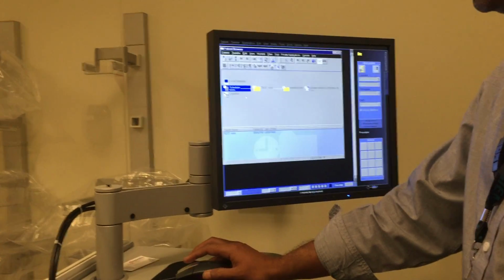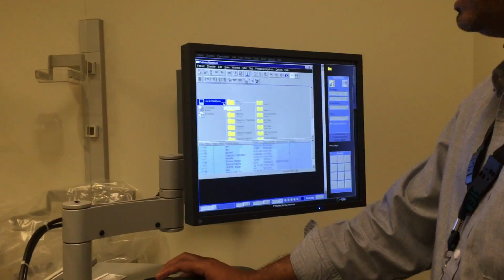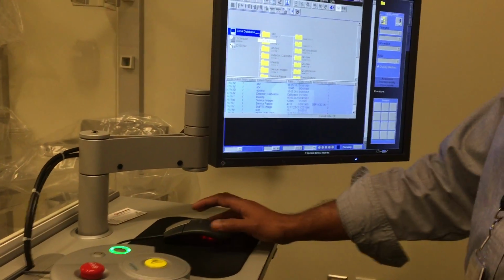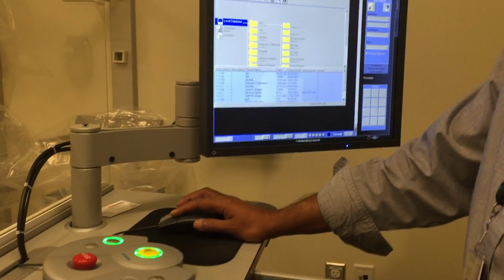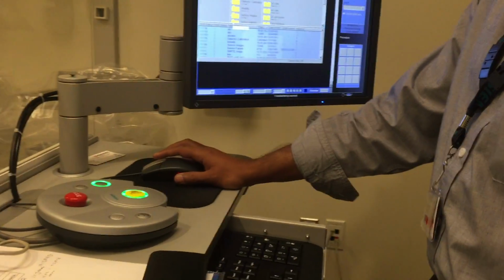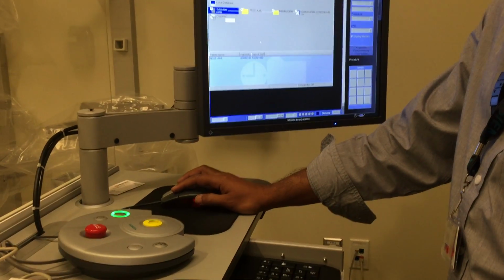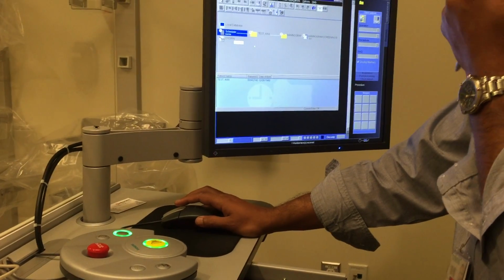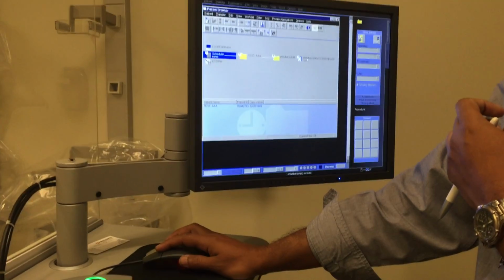So here this is our patient browser screen where you can have a local database. Local database means the local hard drive on the acquisition workstation. So we are seeing the patient list from the AWS hard drive, which are saved, which are done patients. This is the scheduler where we see the work list, which is coming from the DICOM server. So they have already connected here.